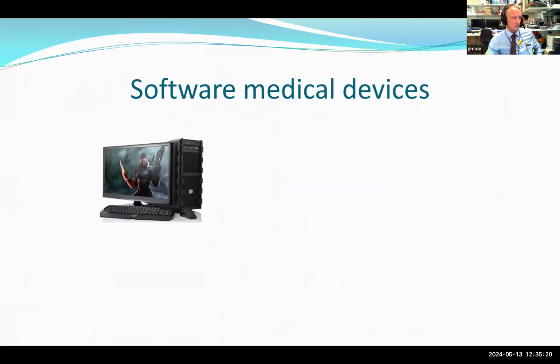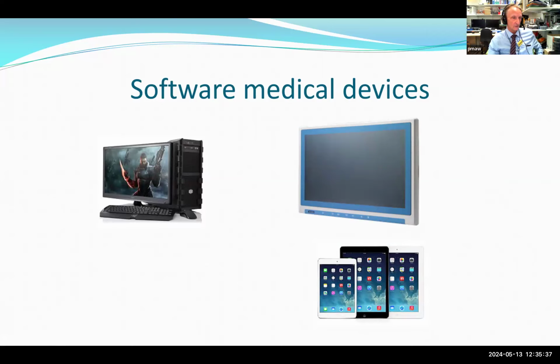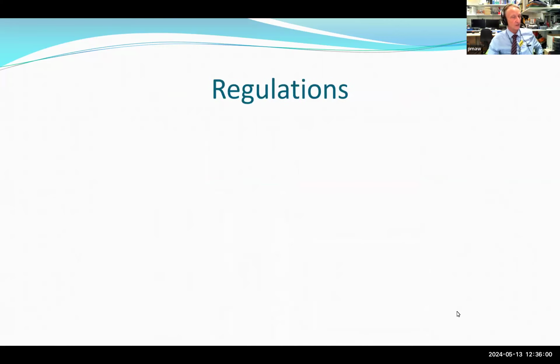And then you have the dedicated software medical devices, which are based around possibly some high-end graphics-capable PC, possibly even a tablet device, with software running on there. An all-in-one medical grade bedside PC can be quite powerful. Smartphones, you can get apps that run on smartphones that are medical devices for sure. And then our old favorite, the Excel spreadsheet. Excel itself is not a medical device, but if it's used in a certain way, a particular spreadsheet could be deemed as being a medical device.